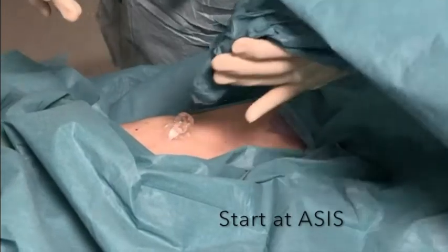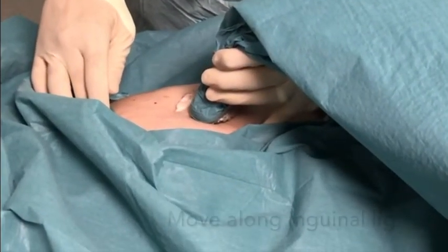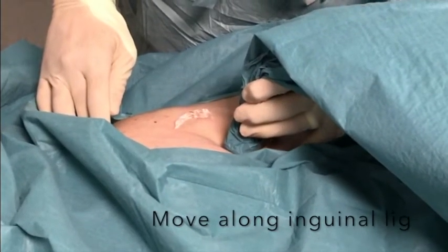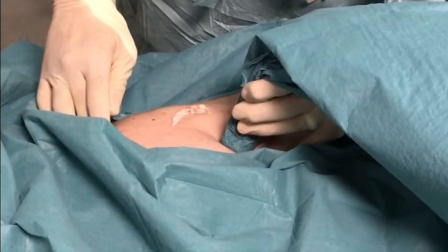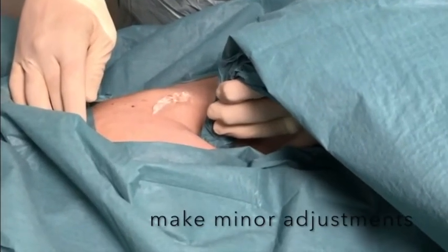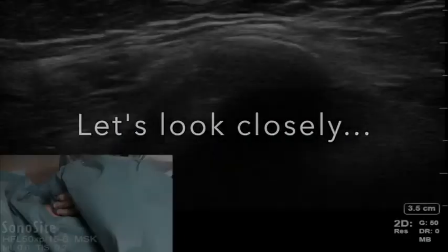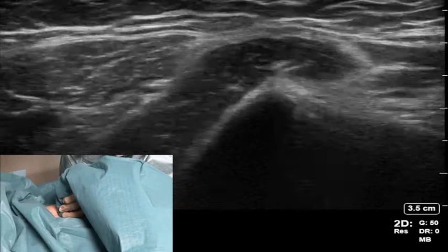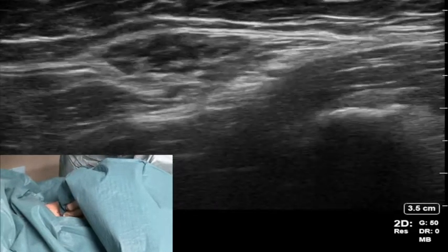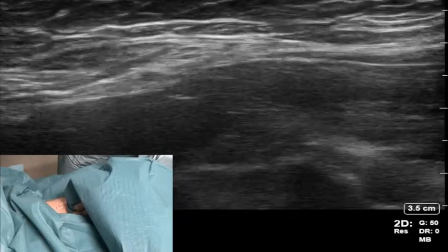Start by placing the ultrasound probe obliquely over the anterior superior iliac spine and slowly moving it medially and inferiorly along the inguinal ligament, then make small adjustments to optimise your image. In this scan we can see the dropout shadow caused by the anterior superior iliac spine, and as the probe moves medially this becomes smaller to reach the anterior inferior iliac spine.